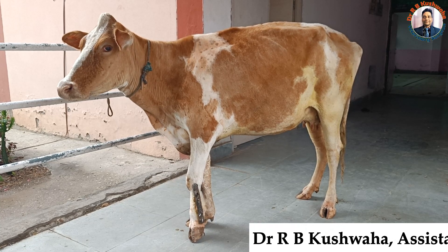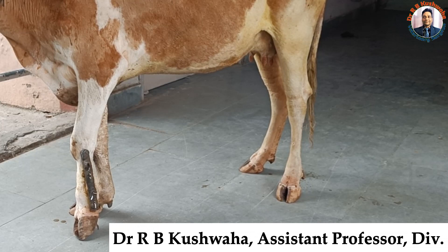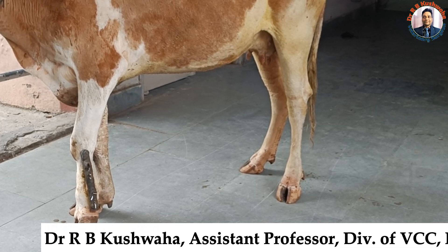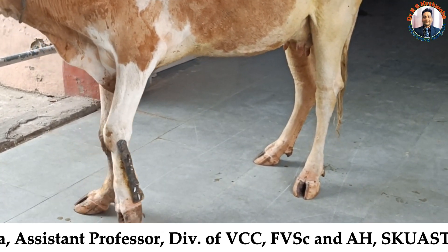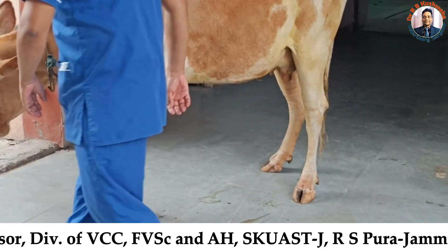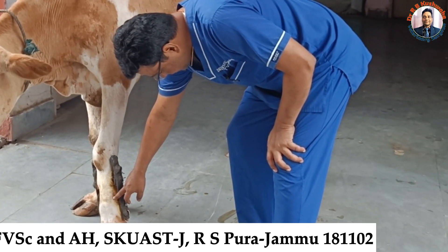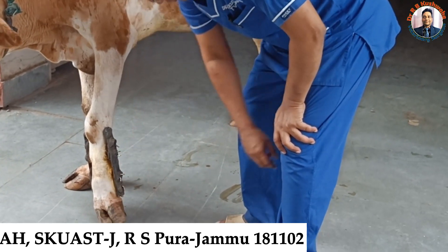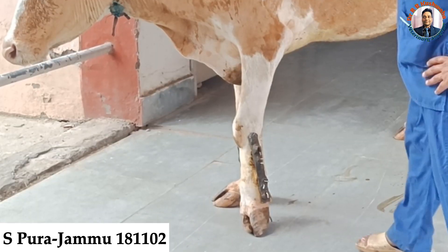Today we have an interesting case, interesting in the sense that this case is presented after two and a half years of application of the external fixator. This is a cow that had a fracture in the left metacarpal region, and this fracture was an open fracture.